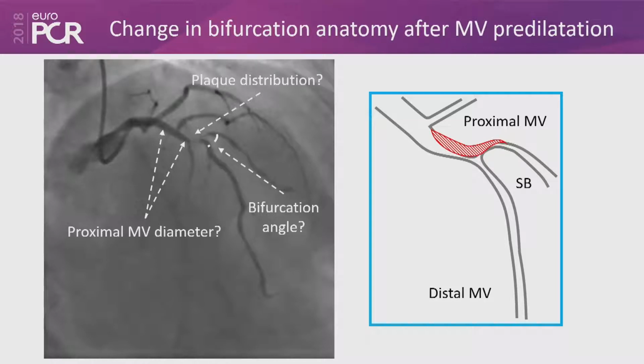To go beyond that would require, I think, an experienced approach. And what is considered to be the gold standard approach at the moment is the provisional approach. So you're always playing on the safe side. If you say, okay, I analyzed the anatomy, I know that the likelihood is high, and I know that the data, the literature, supports the provisional approach, so what I will do, I will place the stent into the main vessel, knowing that there is high likelihood that I will need a second stent, which is what we did. We did a T-stenting at the end of the day.